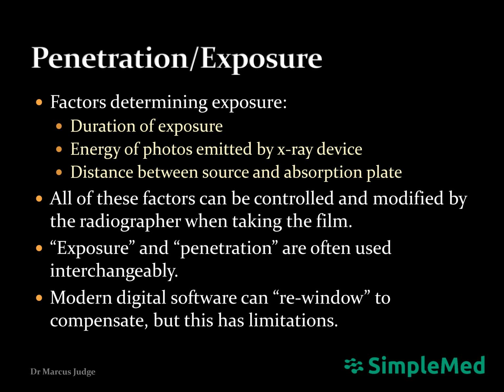Penetration and exposure are terms often used interchangeably, although it is technically incorrect to do so. As discussed in our Basics of Chest X-rays lecture, exposure relates to a number of factors and determines how much and for how long X-rays are fired at the detection plate through the patient. This means images can be under or overexposed. The radiographer can adjust these factors to help create a properly exposed image, and they can be helped further by modern rewindowing technology.